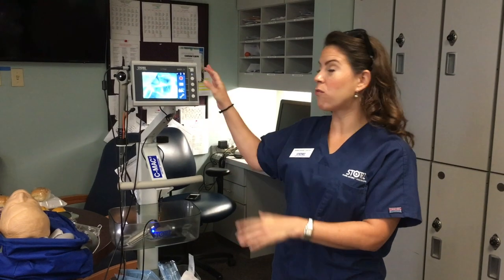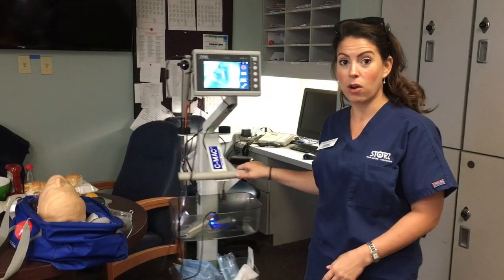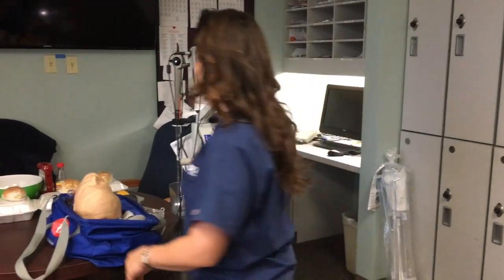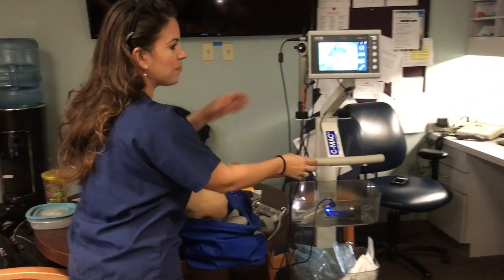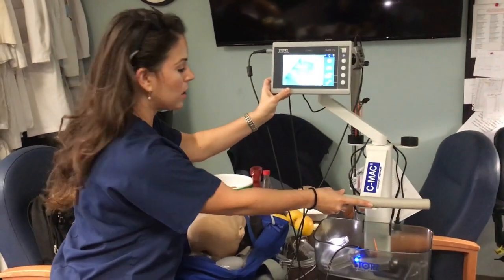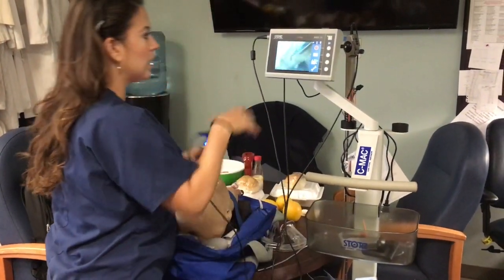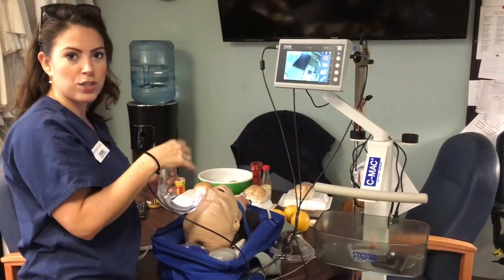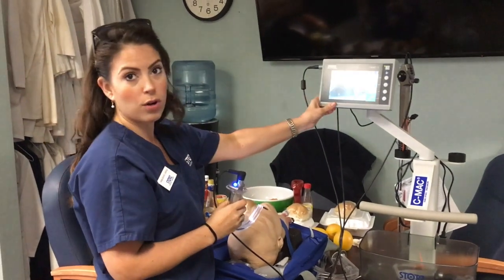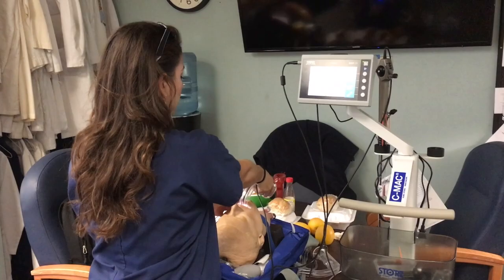To position the CMAC for an intubation, you can easily maneuver the cart. Roll it right up to the bed, swivel the arm, and rotate the monitor so that you are as close as possible to your direct line of sight to intubate. Instead of placing the monitor on the patient's chest or in a bag, it's now on a cart, keeping it close to your direct line of sight.